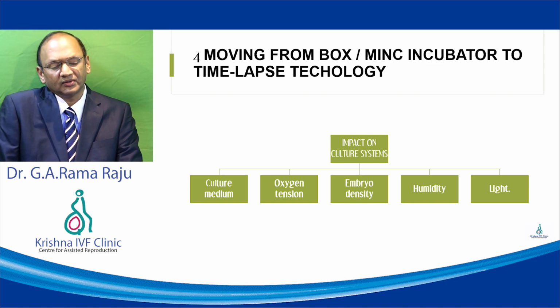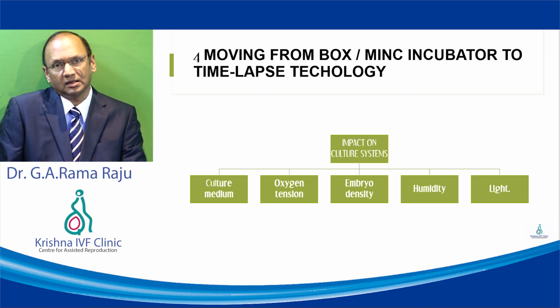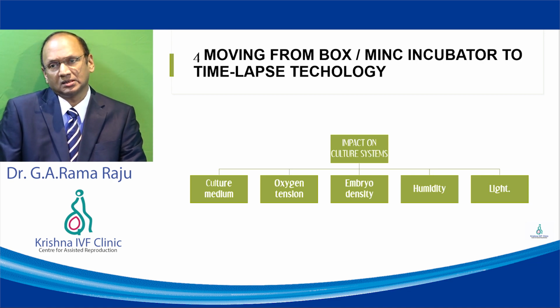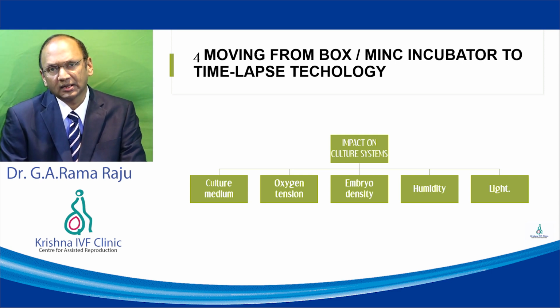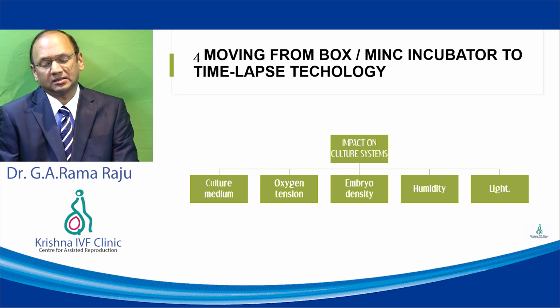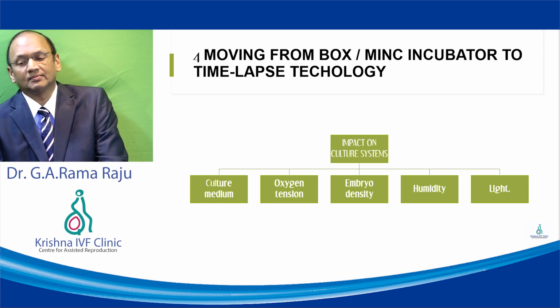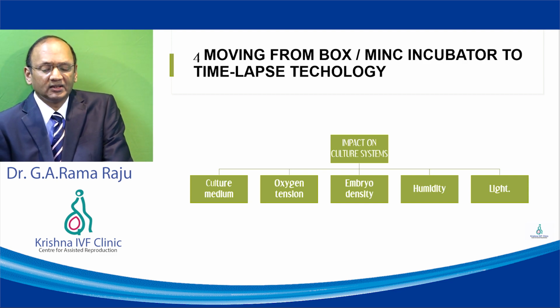These are some of the examples of the time-lapse technology images, wherein you have the fertilization events which are predictors, then you have the cleavage events which also are predictors for the ultimate implantation and the live birth rate. And when somebody is moving from a conventional incubator to a time-lapse incubator, they have to look at the following conditions: the type of culture systems they have, the workload they have, whether they are using the humidity system or the dry system.